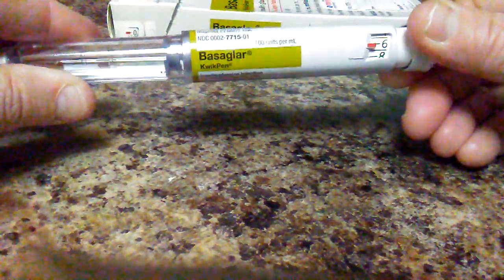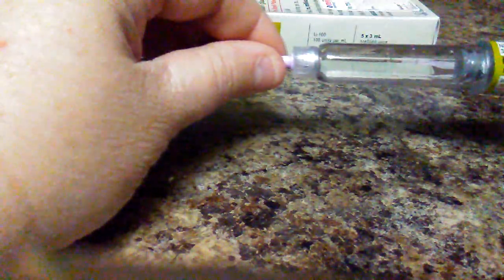You take this off. Then you take the pen and set it to whatever your doctor tells you. Say it's six — ours is 20, so I'm going to put ours on 20. Then you take this cap off.